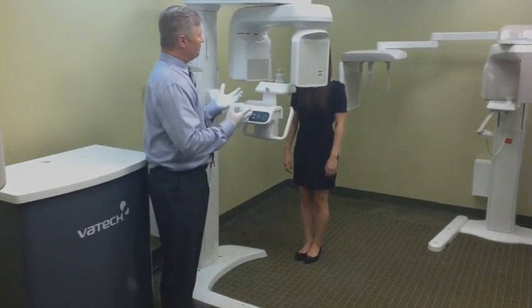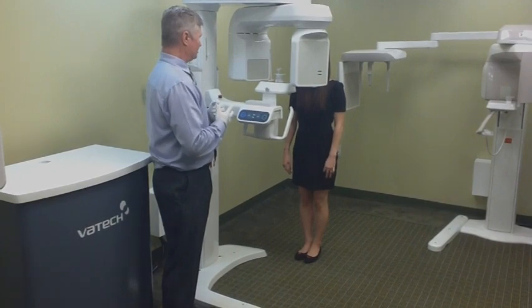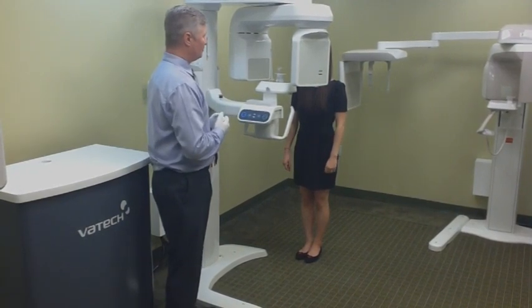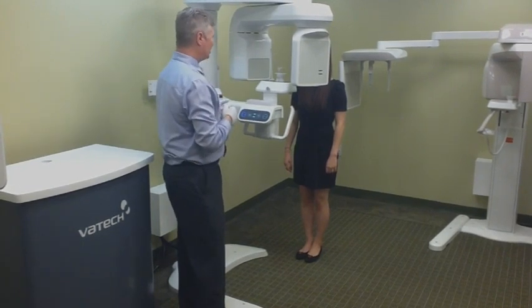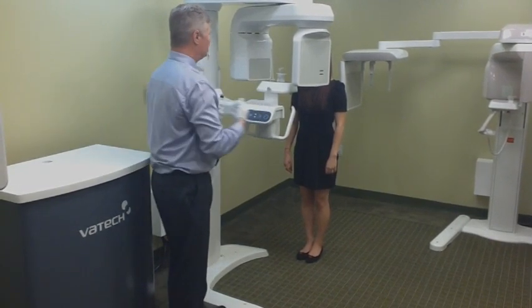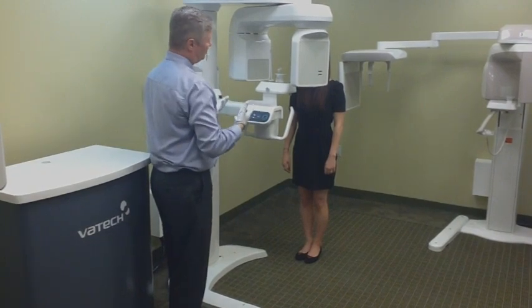Okay, at this point in time, we've now set the device up for capturing our digital panorama image. I've opened up the temple rods here for you. I've also placed a fresh hygiene cover on there for you. Now when you enter the device, I'm going to have you basically do three things for me.